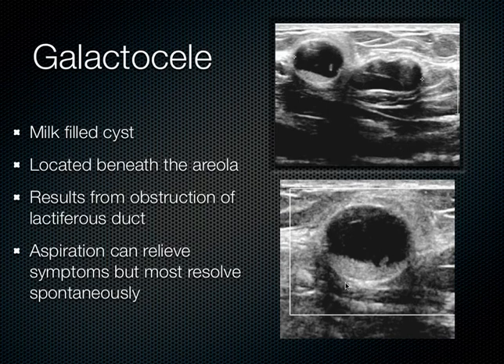When galactoceles are new and composed mainly of milk without any separation, they appear more as solid masses with increased posterior acoustic enhancement. As the galactoceles age, the fat, water, and protein content separates, and they become more cystic in appearance. Typically with ultrasound, a fluid debris level can be seen, and as the patient moves around, this fluid debris level can shift.